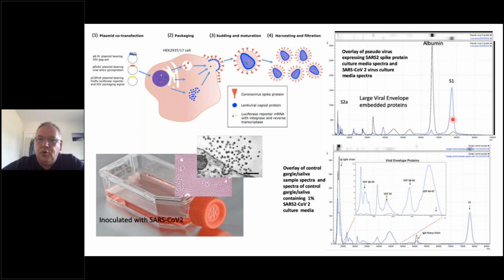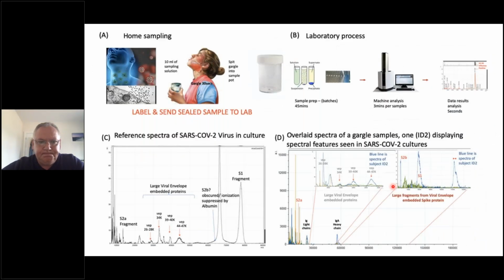So it tends to be very broad peak, and we could actually see a difference in the glycosylation pattern from cells which were grown on Vero cells. So when SARS-CoV-2 was being propagated on Vero cells, and when we started to move into patient samples, we could see that there was a glycosylation difference and this peak was slightly higher. So it is a very broad and complex peak structures that we are getting on our mass spectrometer.